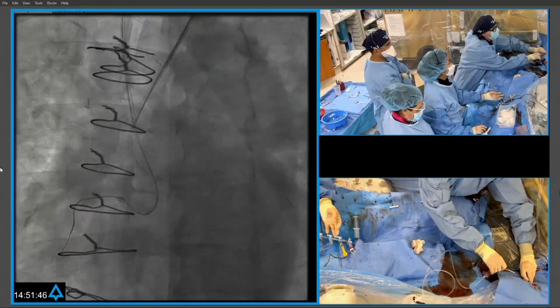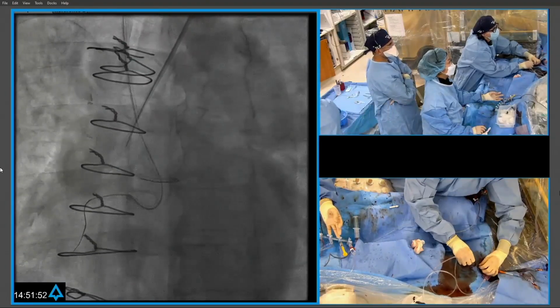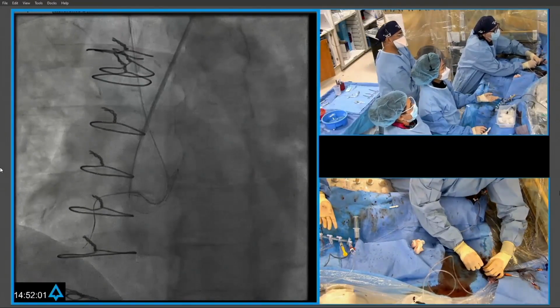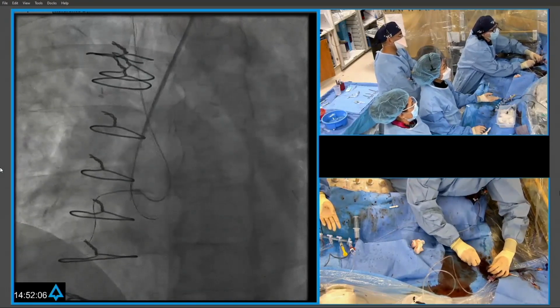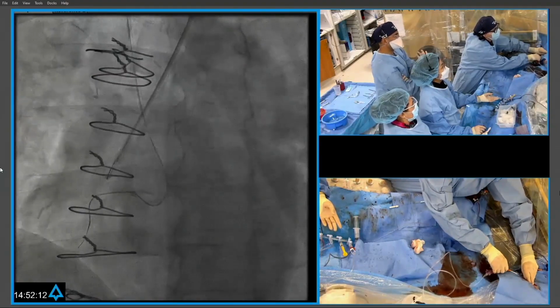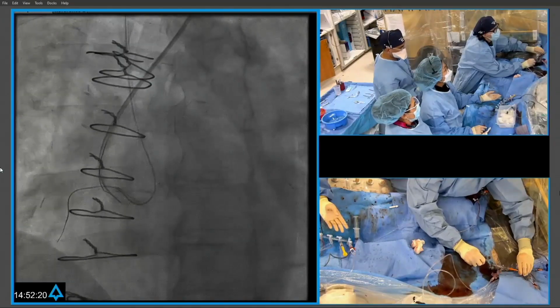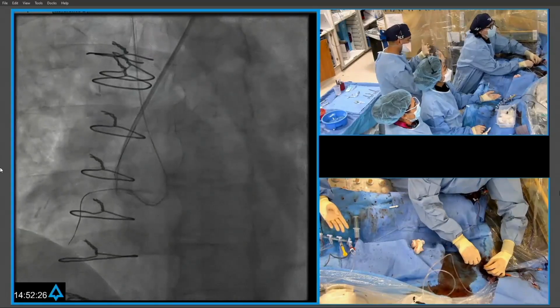We're going to be studying it actively. The Emory folks have studied it in our initial tests that we did prior to CTO Summit, which is when we got it. When I was wearing a real-time dosimetry badge at the end of a complex PCI case, I was up front. My exposure was, if I did 1,000 of those cases a year, it would be less than what's allowable, the 5 rem limit for the year. Now, admittedly, this is with digital dosimetry. It's not the same as analog dosimeters. There can be other scatter, but that's why we're going to study it more aggressively. What we definitely also found is if you're in the second position and down here, though, the radiation was almost minimal. And what's cool is it protects the whole body, not just where you're wearing lead.